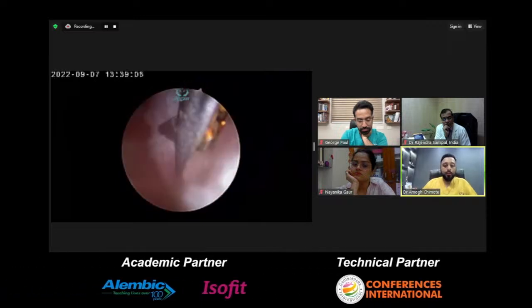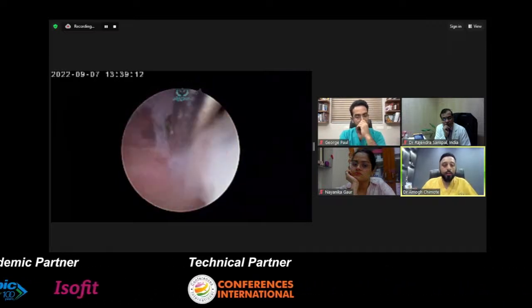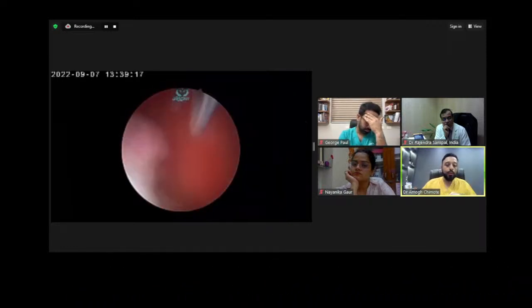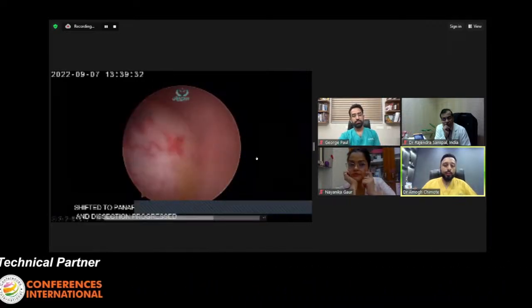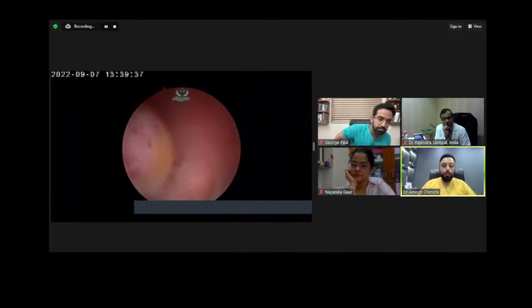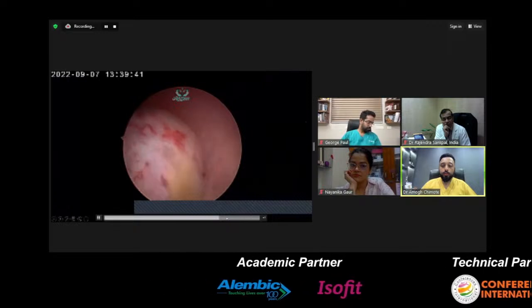With this, you can see that we can go fiber by fiber, cut it, and just look at the decidua. Do not encroach the myometrium. Once I thought that the incision was completely over, I shifted to panoramic view, but a small portion of it was still left. So I went there with the scissor.